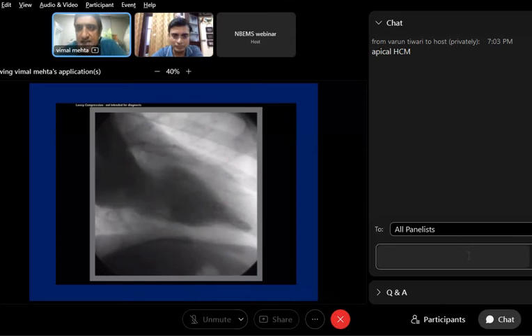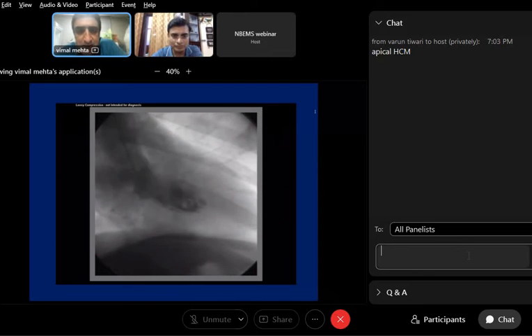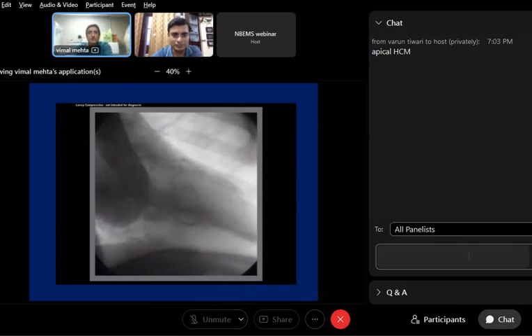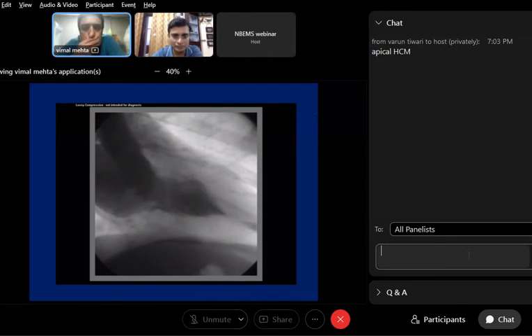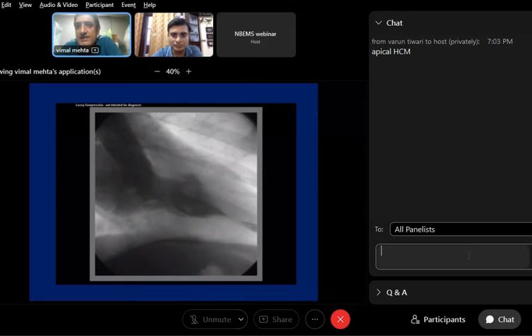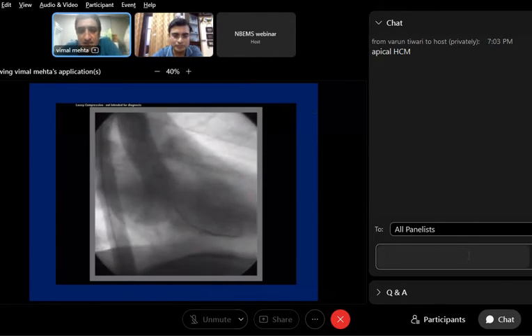See, what is the catheter doing? Is it normal sinus rhythm or is something else happening? That's what I want to ask. And that is exacerbating the whole issue. So our injection is causing a lot of VPCs. Very good. Somebody has answered. So they are catheter-induced ectopics.